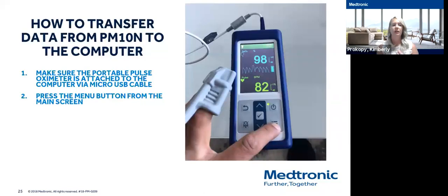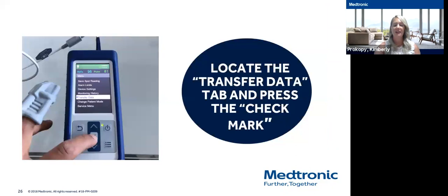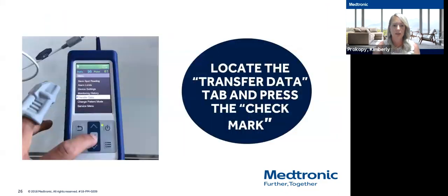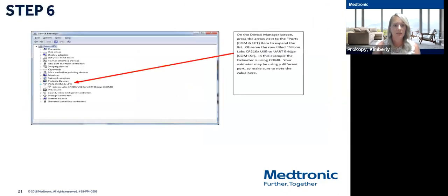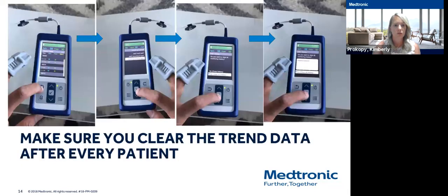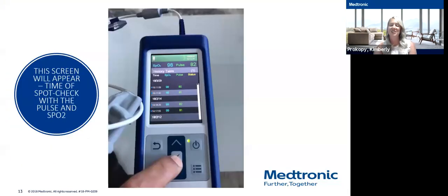You want to make sure it is attached to the oximeter first and then the computer. Okay. I know I have a slide on it. Now I won't be able to find it, but yeah, it's oximeter, then computer.